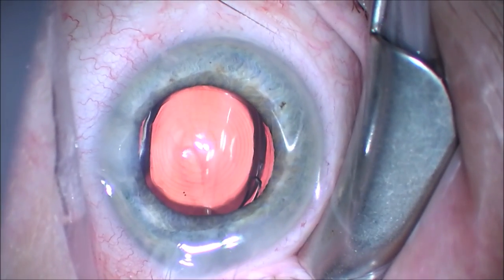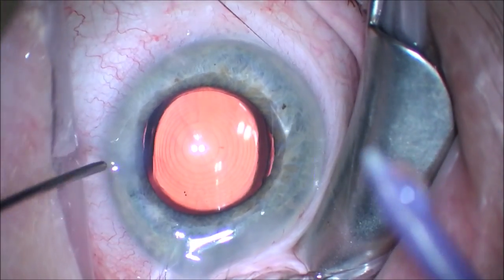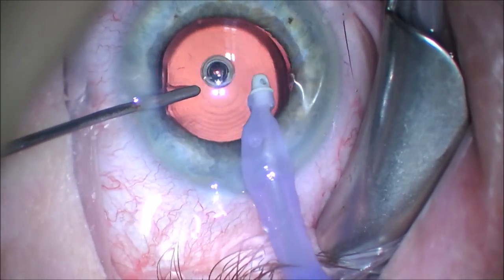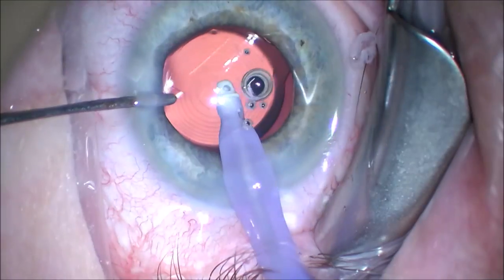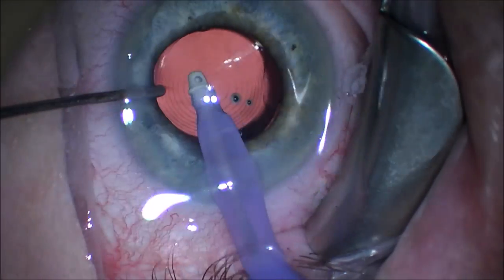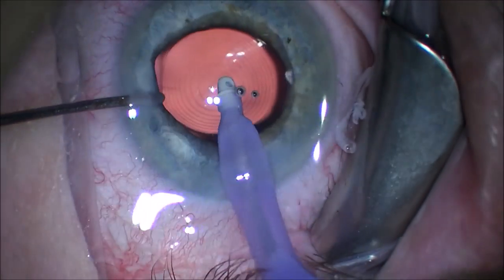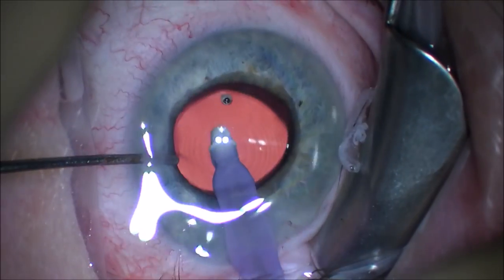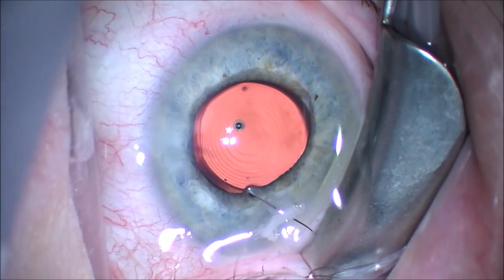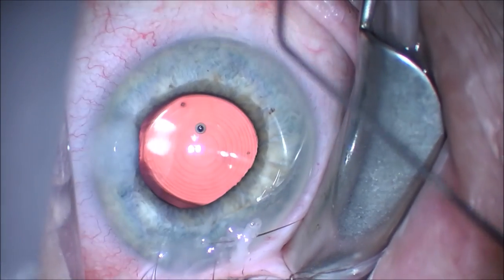You can see that we hydrate the wounds with balanced salt solution in a 27-gauge cannula. Now we're going to remove the viscoelastic that is in the anterior chamber and behind the intraocular lens. It's important to remove the viscoelastic behind the intraocular lens as this gives the Symphony lens, or any intraocular lens, a much more stable foundation to scar into place. You can see here we are pushing down on the posterior capsule and posterior chamber implant to remove that viscoelastic sandwich between the two layers. We then hydrate the wound again.